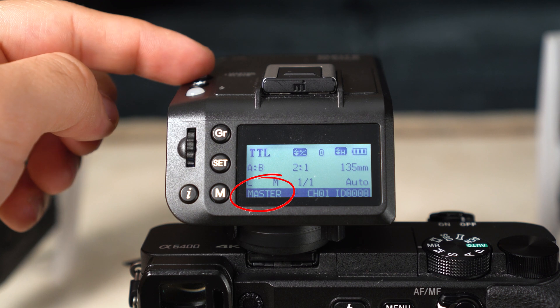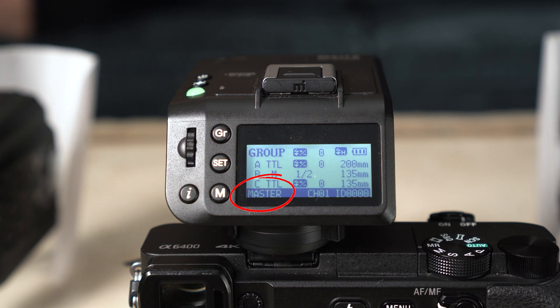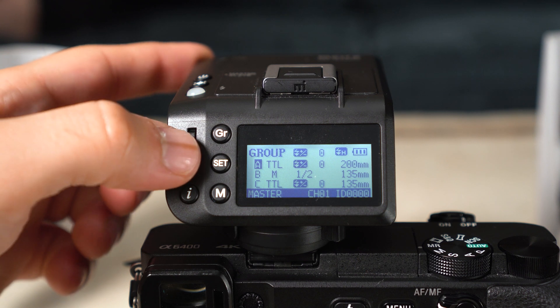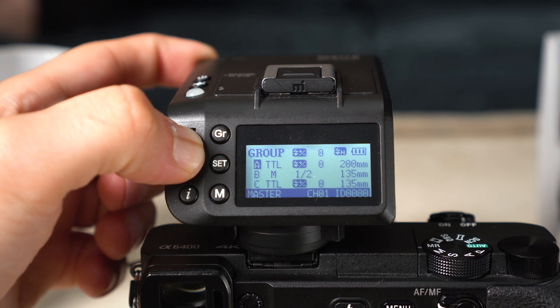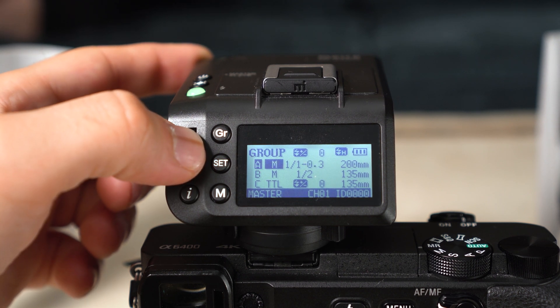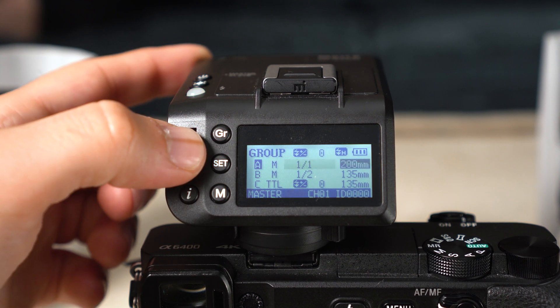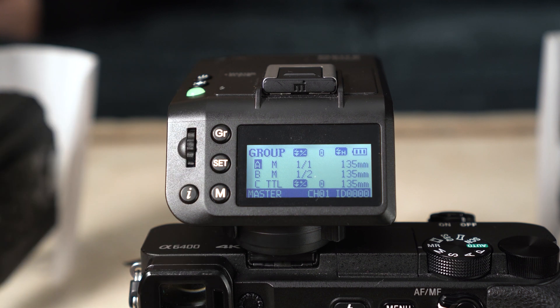For the Meike twin flash: turn it on by holding the power button. The flash has two modes — slave and master — switchable by pressing the power button. Enter master mode. You'll see three groups. Press the Group button so Group A is highlighted, press the scroll wheel to enter, turn it to M (manual), then scroll to set the power to 1/1 (full power), and set the focal length to 135mm. Do the same for Group B but set the power to half.